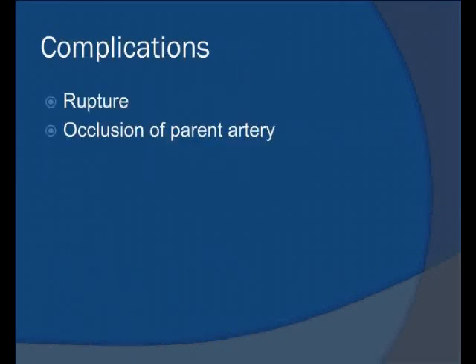What are the complications? You can have a rupture if you do the case. You can have an occlusion of the parent artery because of a thrombus.